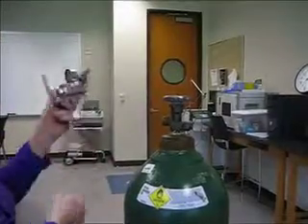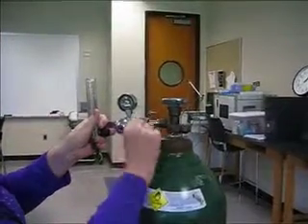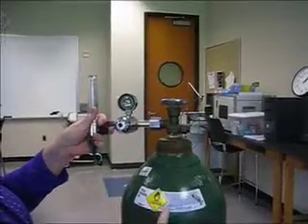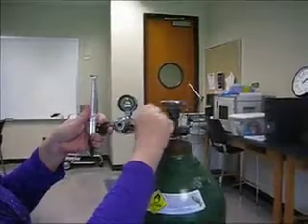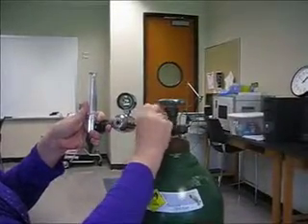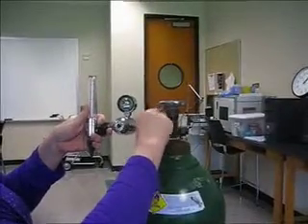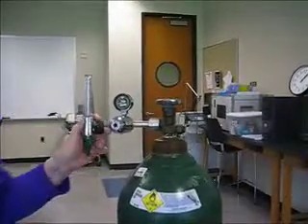Now I'm going to thread this onto here, and I know it fits because it's oxygen, and this is an oxygen tank. I know it's oxygen because I've read it, and I know that this is oxygen because I've read the regulator. You can only hook oxygen up to an oxygen regulator because it's part of the safety system. This is a high pressure connection, which is also part of the safety system.